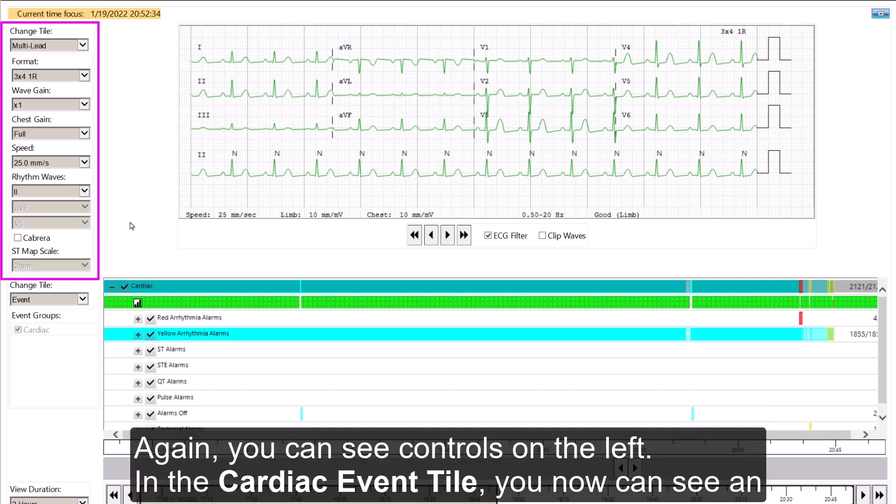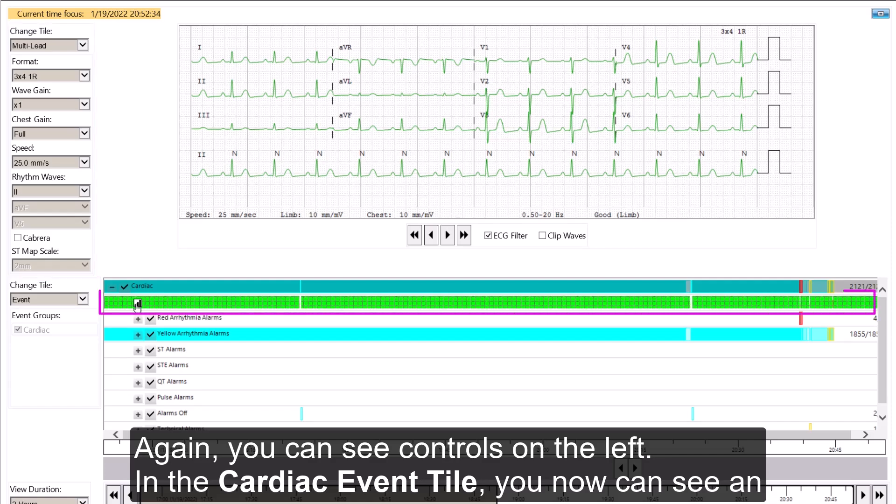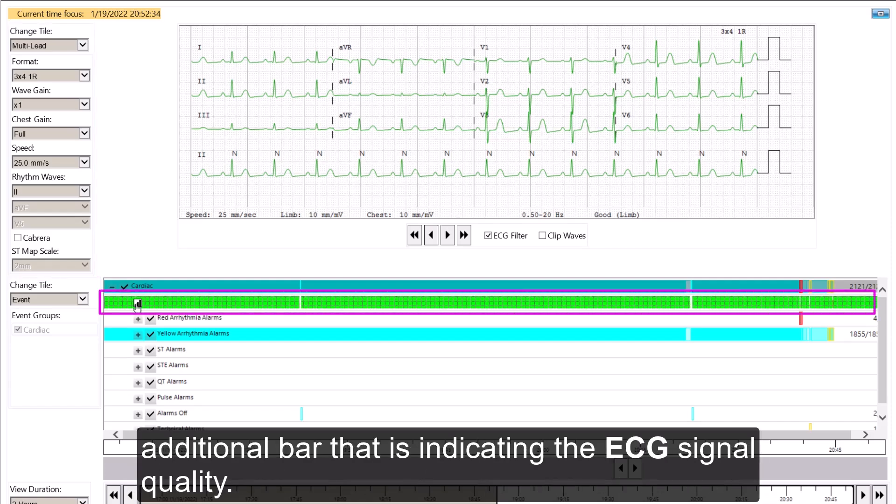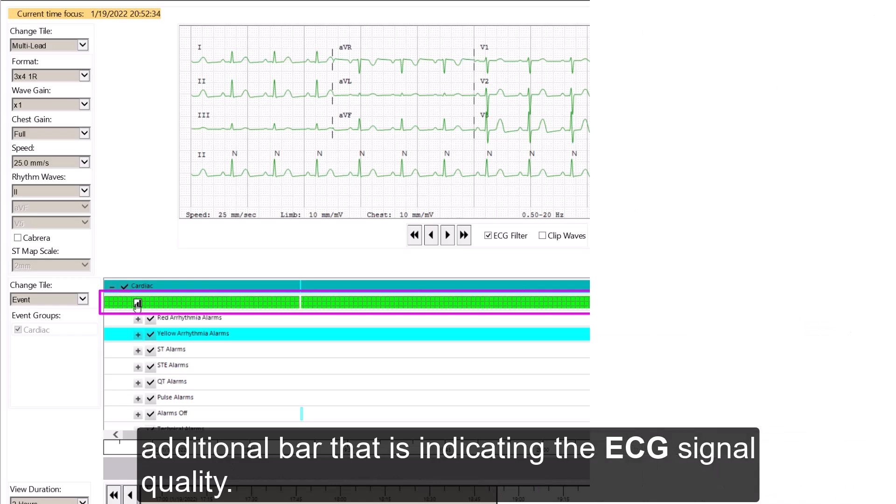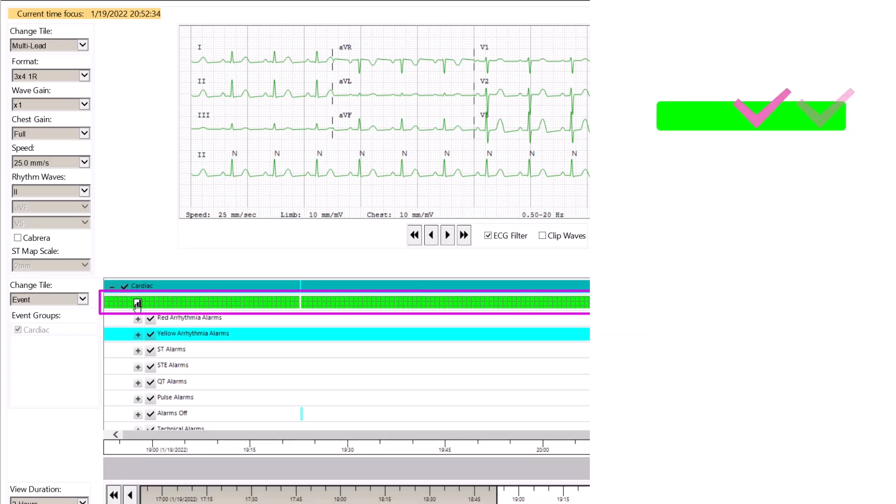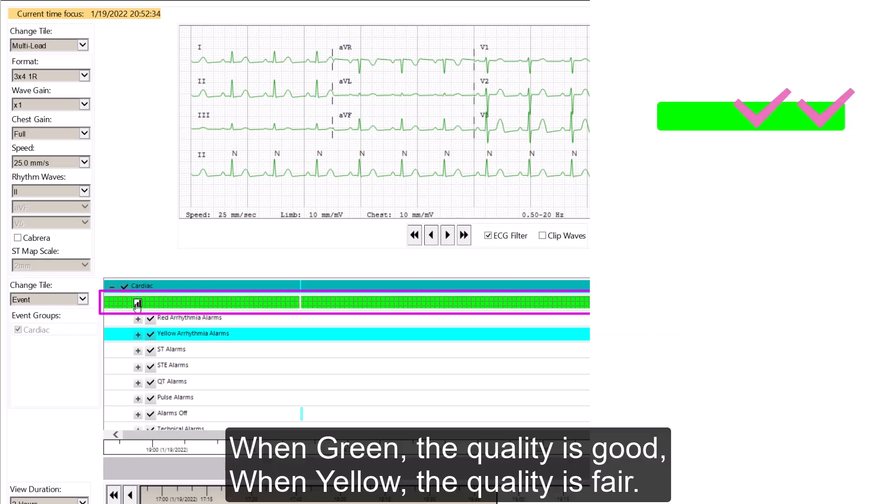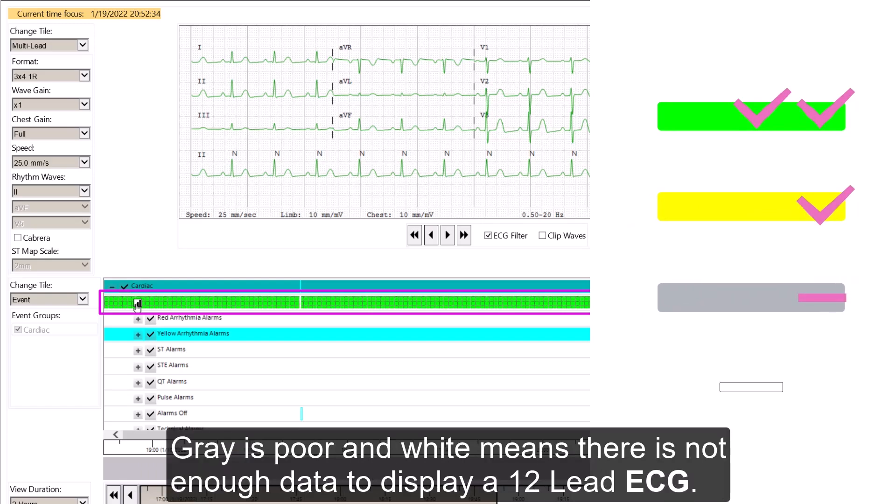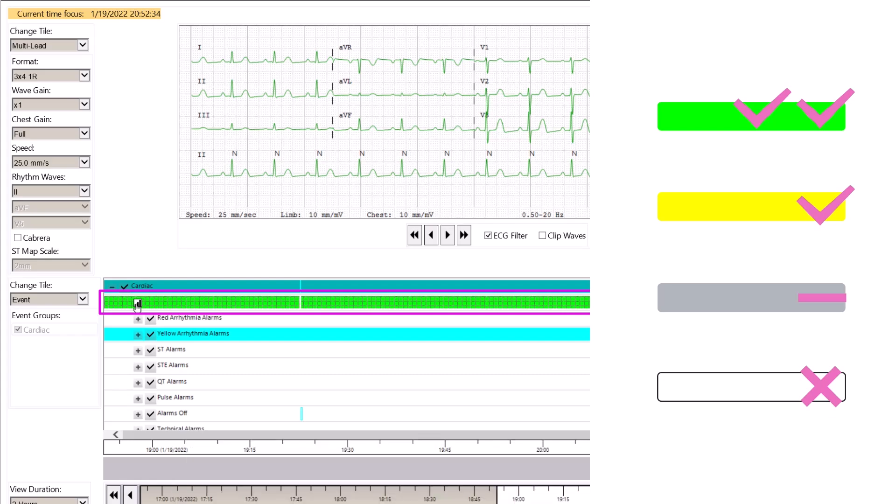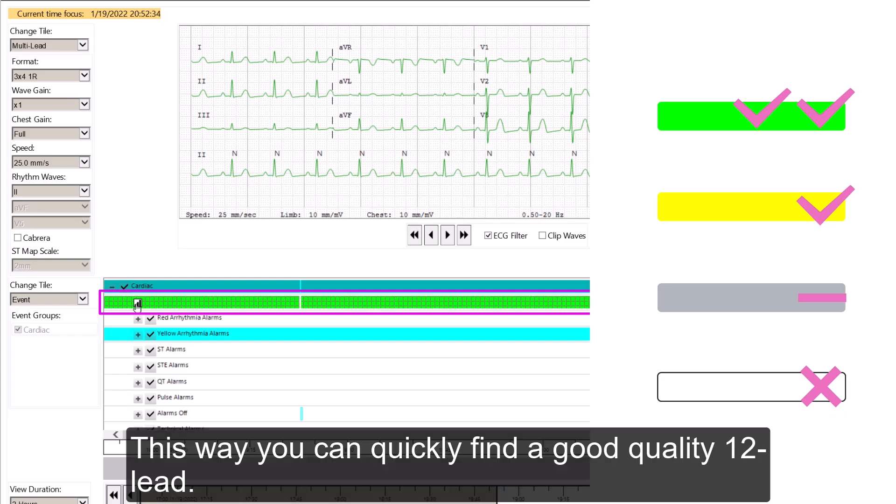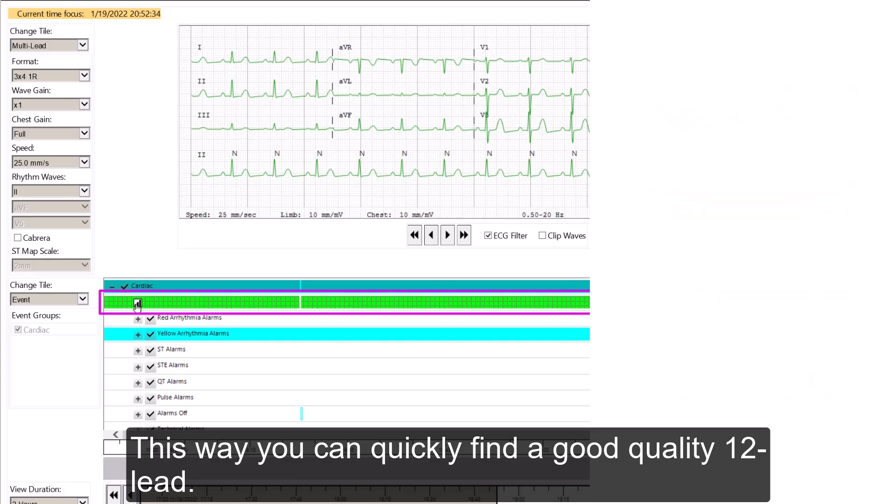Again, you can see controls on the left. In the Cardiac Event tile, you now can see an additional bar that is indicating the ECG signal quality. When green, the quality is good. When yellow, the quality is fair. Gray is poor, and white means that there is not enough data to display the 12 Lead ECG. This way, you can quickly find a good quality 12 Lead.